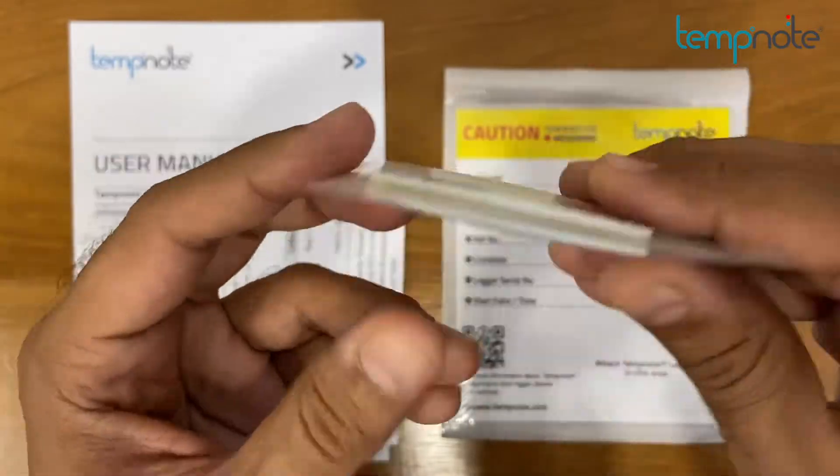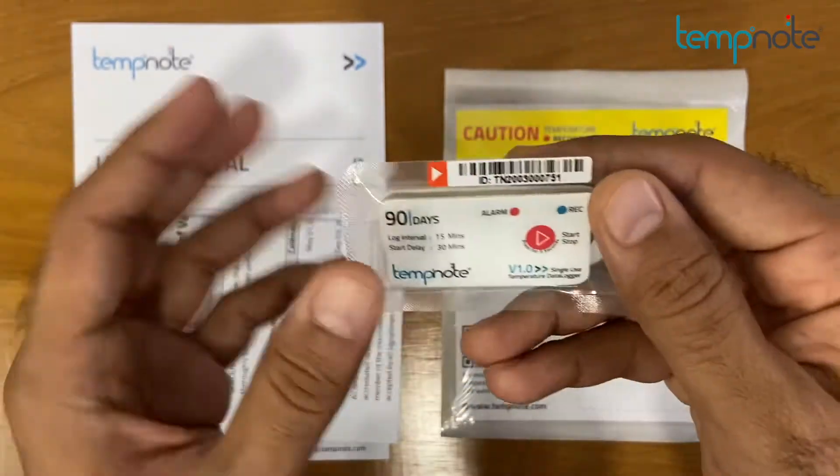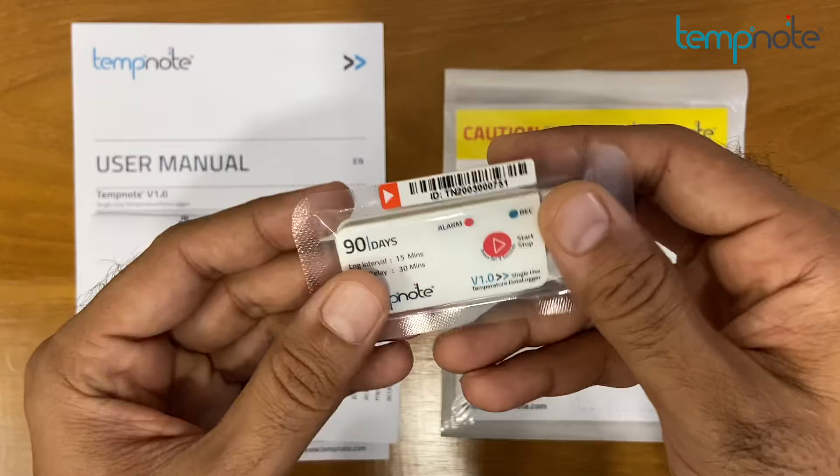TempNote V1 offers an integrated USB port, so no additional cable or reader is required. The device supports transit time up to 90 days with a 15-minute log interval.